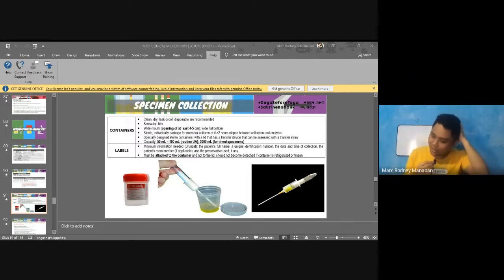So, saan tayo prioritize una? Ang culture or ang routine urinalysis? Yes, and so may final answer na to. Wala na, okay na to. Culture or urinalysis? Asa man na itong iuna? Ala, yes, ng mga shy type.